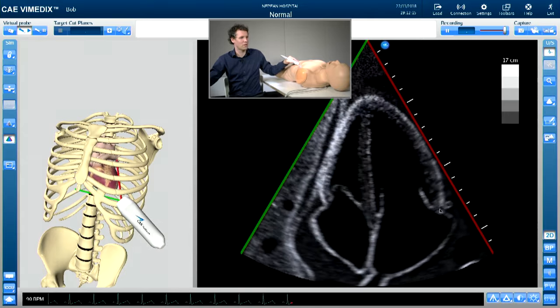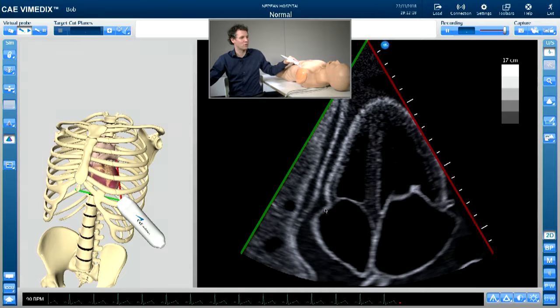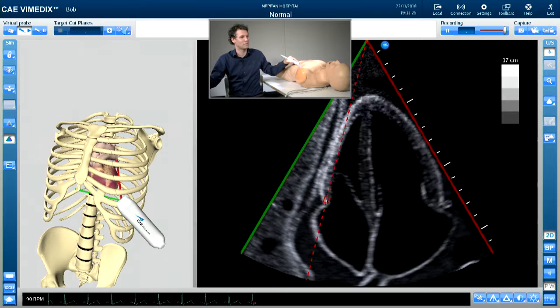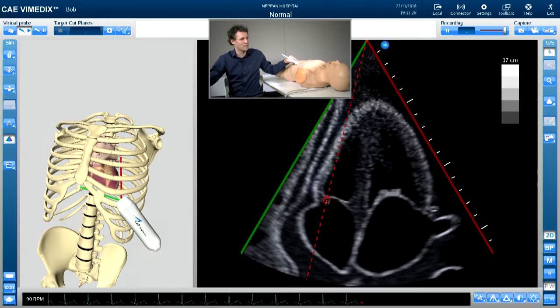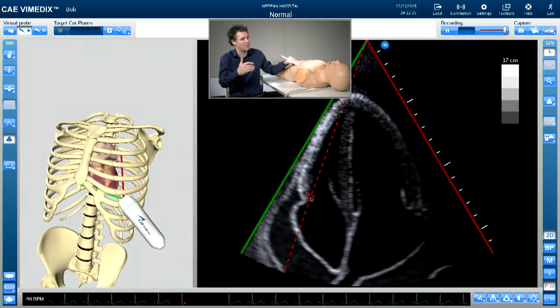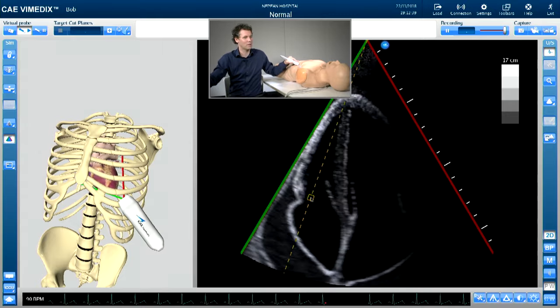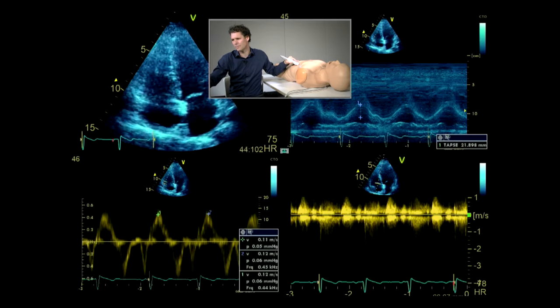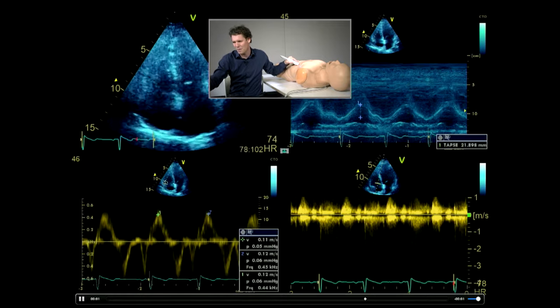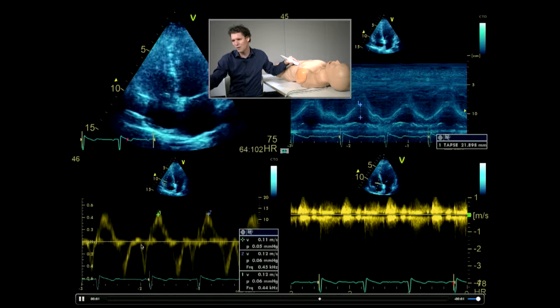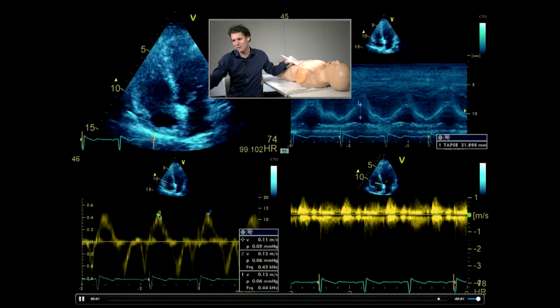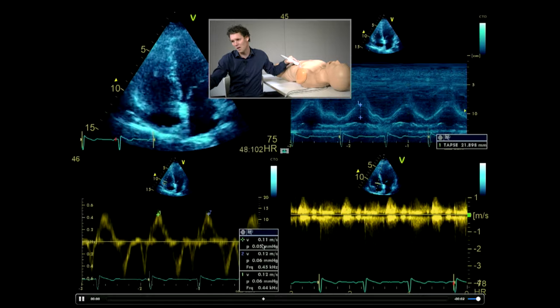After the tricuspid regurgitation, we can use our tissue Doppler as well. As well as looking at tissue Doppler in the lateral and medial mitral annulus, we can also look at it in the lateral annulus of the tricuspid valve, giving another idea of systolic function. It's Doppler dependent, so I try and keep that septum in the middle of the screen and optimize as best I can, trying to look at how fast that annulus is moving towards the apex of the heart. In the bottom left image, using tissue Doppler imaging looking at the speed of the S wave - the systolic motion of that lateral annulus towards the apex - you can see a velocity here of about 11 or 12.